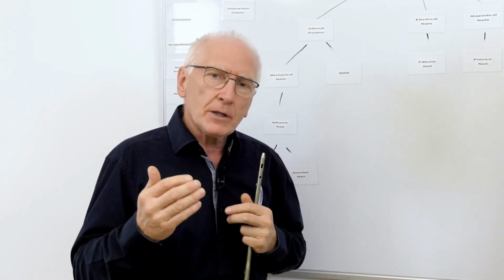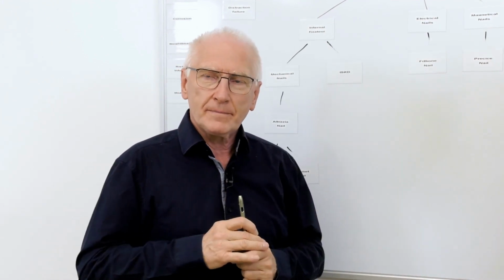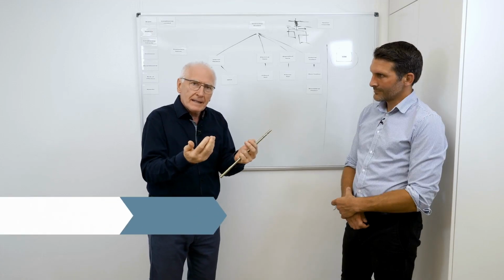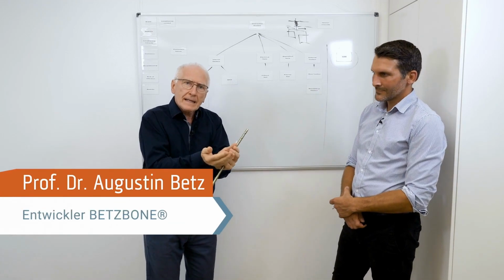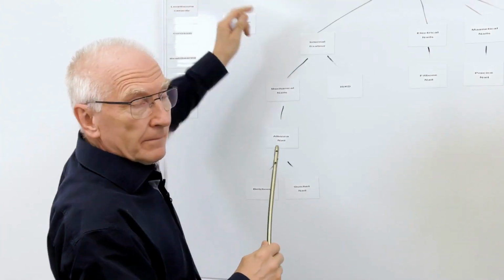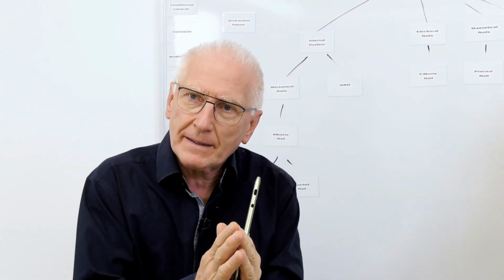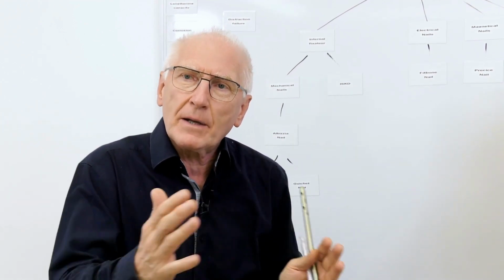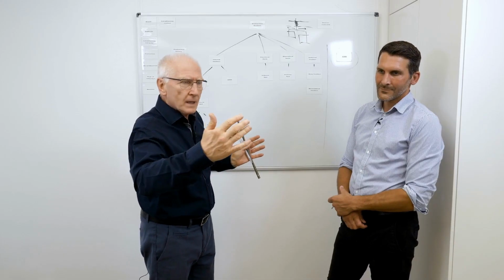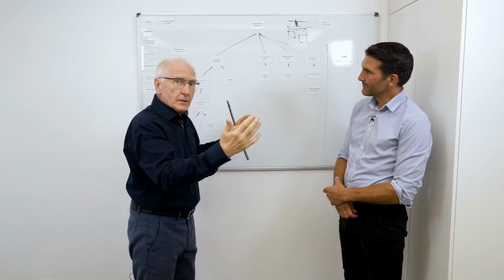And the strength is not trivial to incorporate into the interior of a nail. If I build more inside now, I have to thin the outer wall. Then it is again not enough for stability. If I make the wall too thick, my motor becomes so small in diameter again that it doesn't deliver any torque and it stops. It doesn't have the strength to move apart. And that's why, in the end, we returned remorsefully from this group of nails.